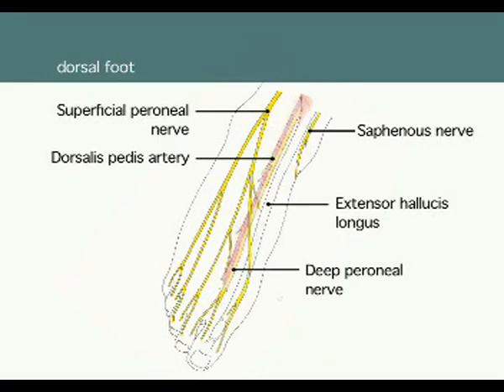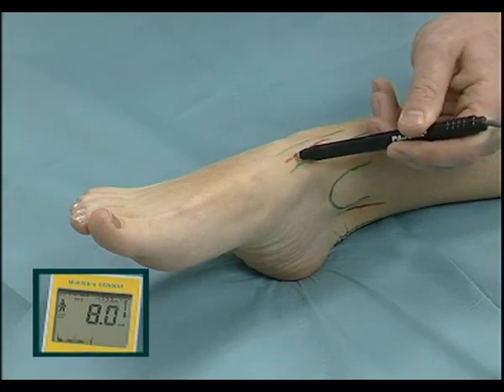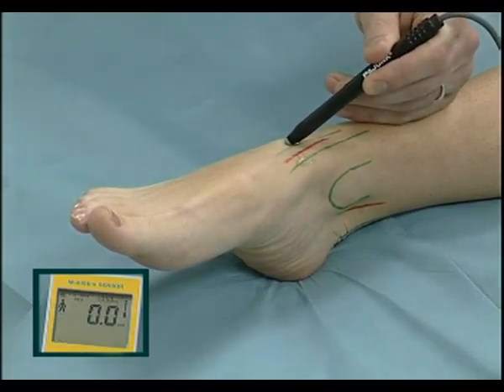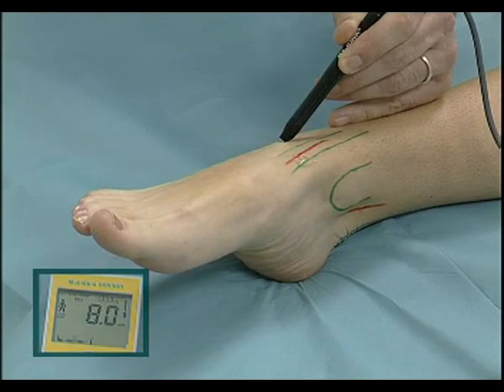Saphenous nerve lies anterior to the medial malleolus, and paresthesia is into the medial aspect of the foot. Deep peroneal nerve. It lies between extensor hallucis longus tendon and tibialis anterior tendon alongside the dorsalis pedis artery. Paresthesia is into the first interdigital cleft. Superficial peroneal nerve. It lies lateral to the dorsalis pedis artery and divides superficially between the medial and lateral malleoli. Paresthesia is into the toes.